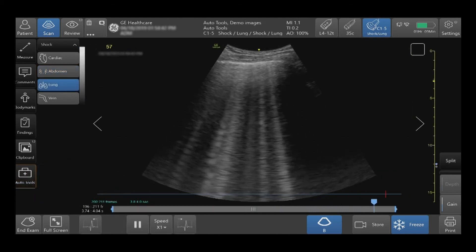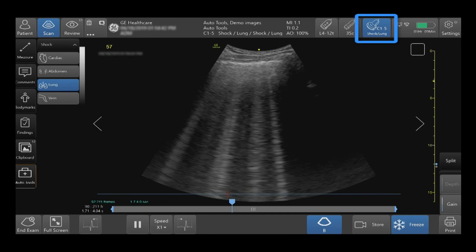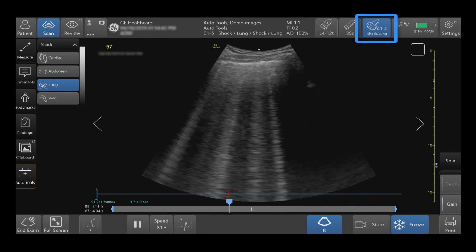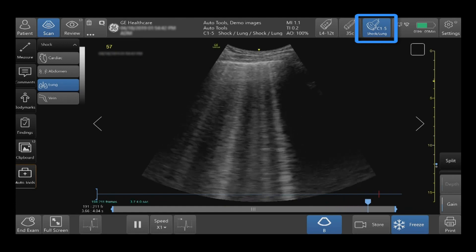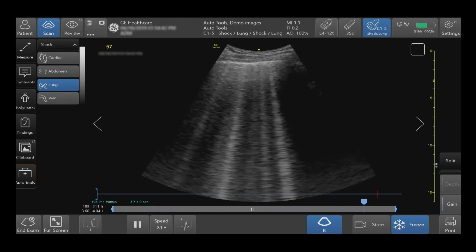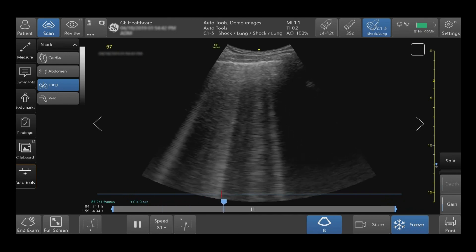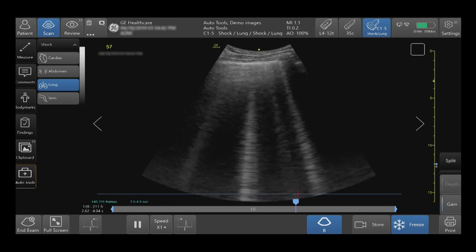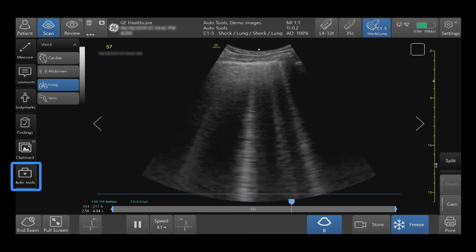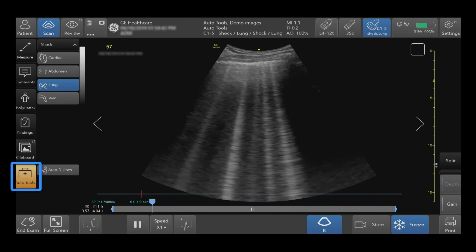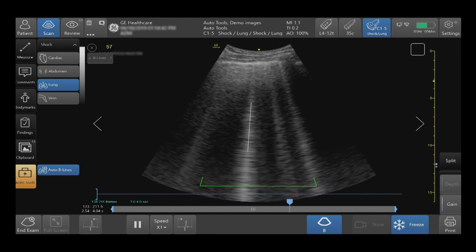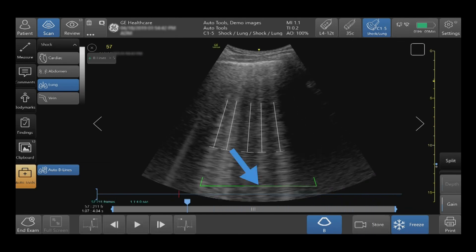To properly use the Auto B-Line Auto tool, select the correct probe and preset. In this case, I will be using the C1-5 probe and the lung preset. The Auto B-Line tool highlights and counts the number of B-Lines in real time. Using B-Mode, demonstrate the desired lung space. Activate the Auto Tools tab on the bottom left hand side of your touch screen, then tap Auto B-Lines. When live scanning, your quality indicator will appear.